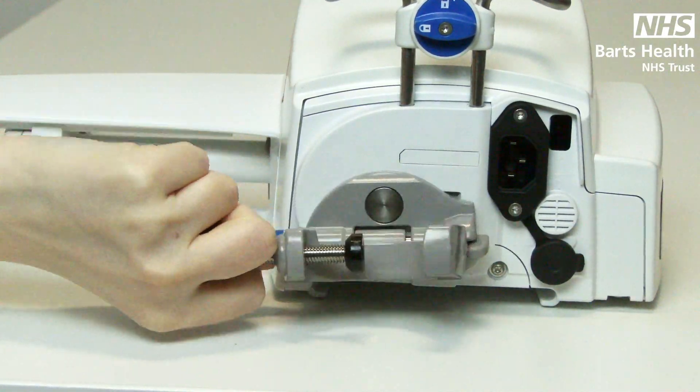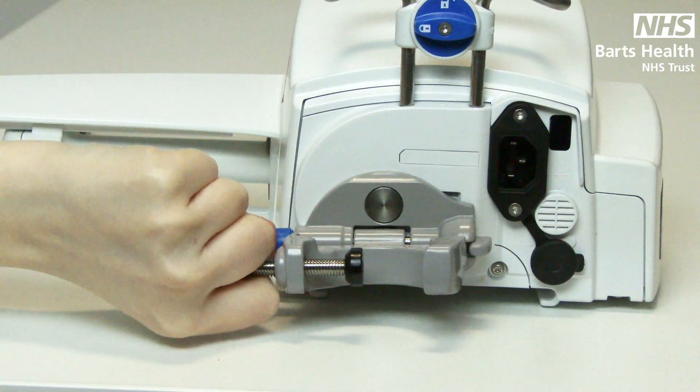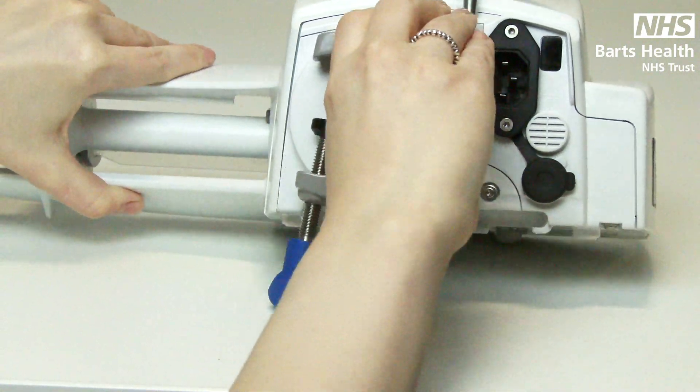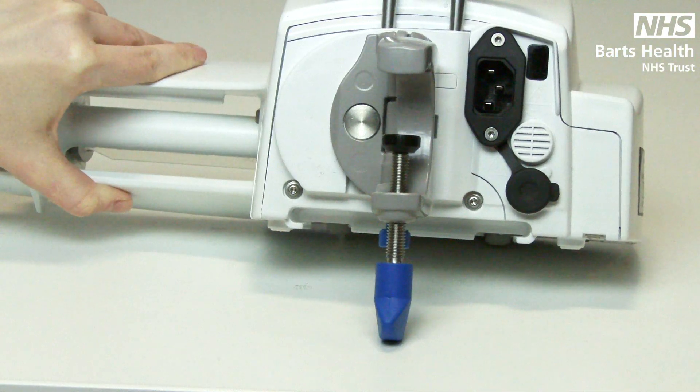Push down to release for IV stands. Push down to lift back up — this position is recommended for storage. At the point where it's flat to the pump you can also spin around, push down and release for bedside or ambulatory pole carrying.